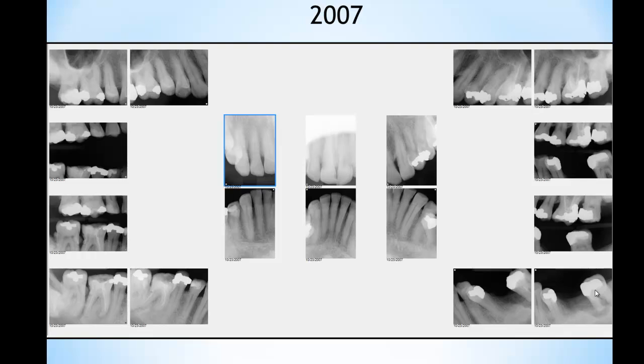So first I explained to him that if we have to do some of the restorative stage here, we have to probably do a full rehabilitation case, and explained to him how it works. The patient is insurance based, and he wants to do it, but it's not his priority. He's an old man, and he doesn't want to do all this cosmetic work, correcting his bite, since he doesn't have any complaints. So I came to approach this case a little bit differently.